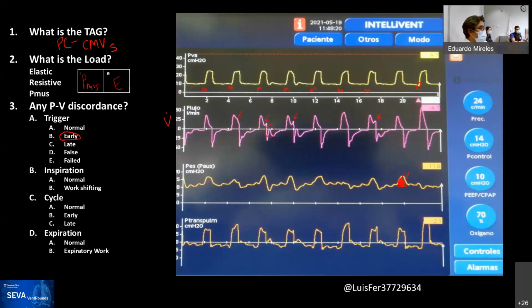There's a subgroup of patients that have what we now call reverse trigger, that particular pathway, which talks about the neural conduction. Something triggers, either by stretch receptors or displacement, and it generates the signal to the phrenic nerves or to the medulla to generate a contraction.